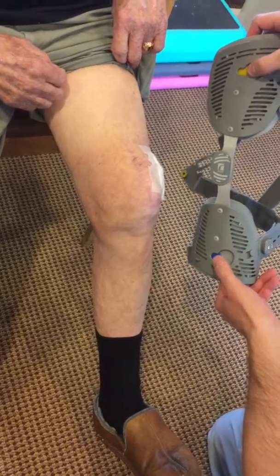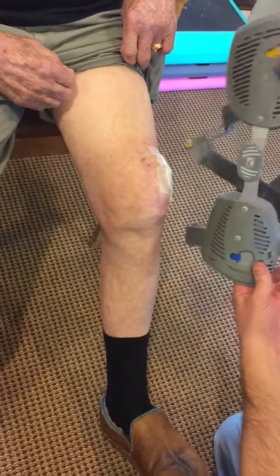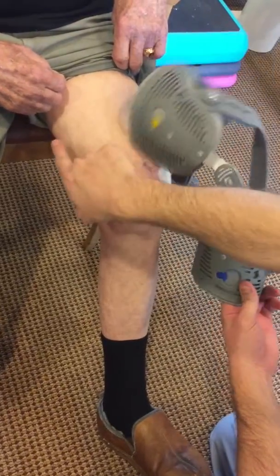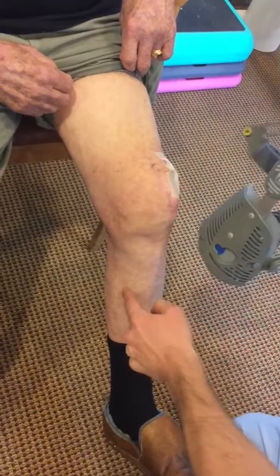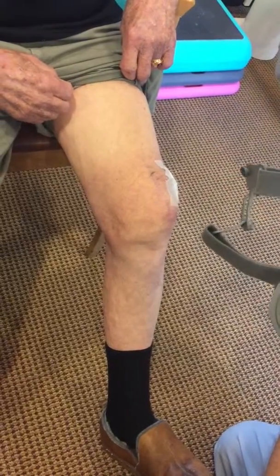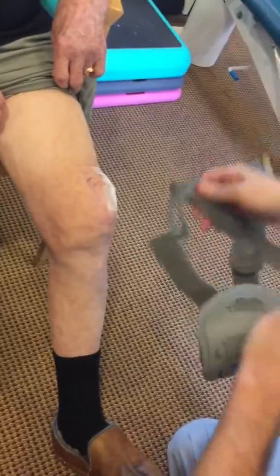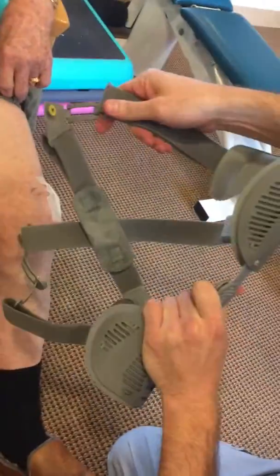There are blue and yellow tabs on the top and the bottom. The hinge should be on the inside of his knee, so the yellow dot should be at the top of the thigh, and the blue should be at the calf. There are little circles that will be going into these slots as we're applying it — the blue to the blue, the yellow to the yellow.